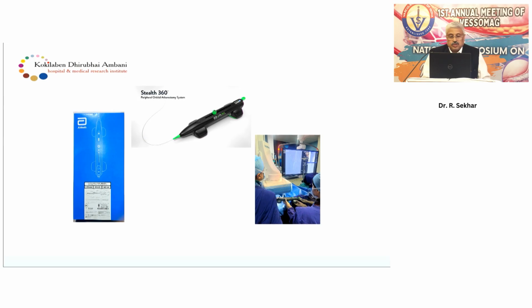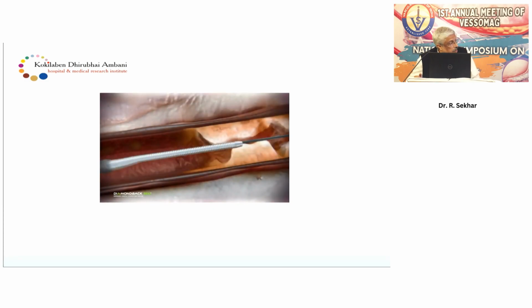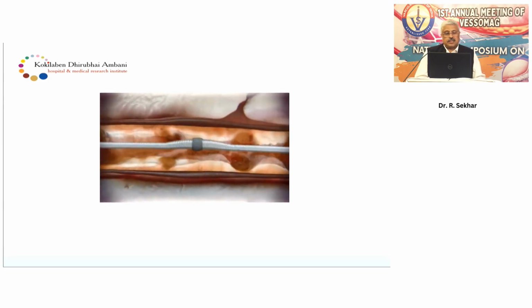And so what we used was a Stealth 360. Now this would probably be the ideal lesion where you have a single vessel, unable to do a bypass, in a no-stent zone. So we used this, and let's hope this plays. I think this is playing. Basically, this is just a demo to show you exactly what the Stealth 360 does. This is meant for short segment calcified lesions.